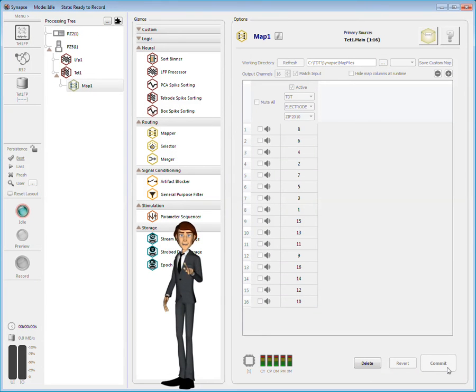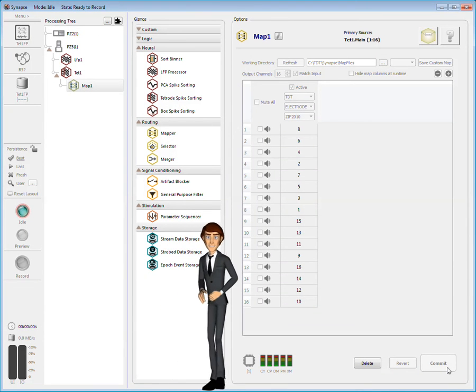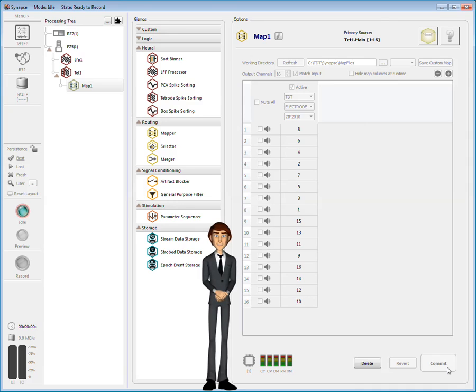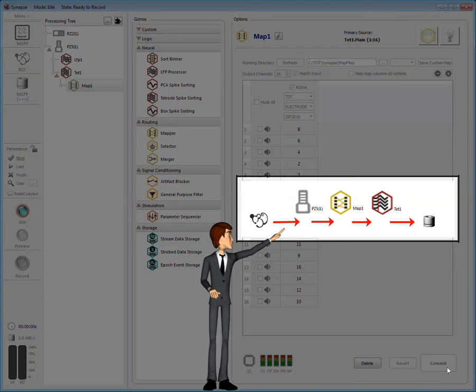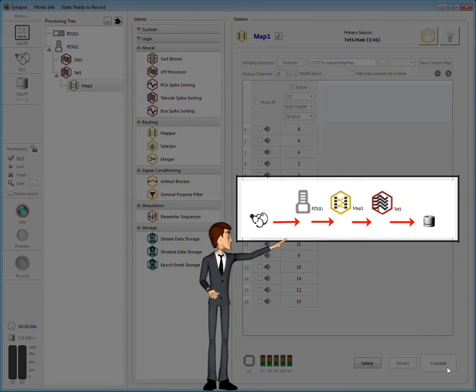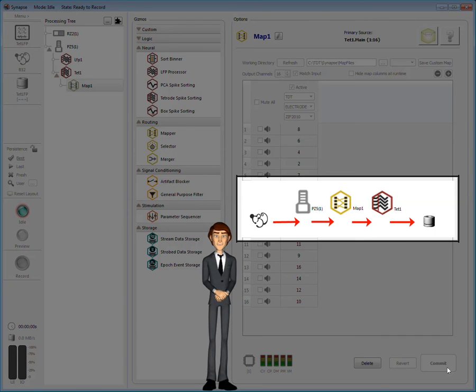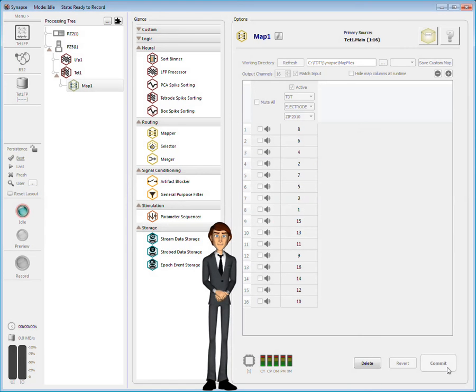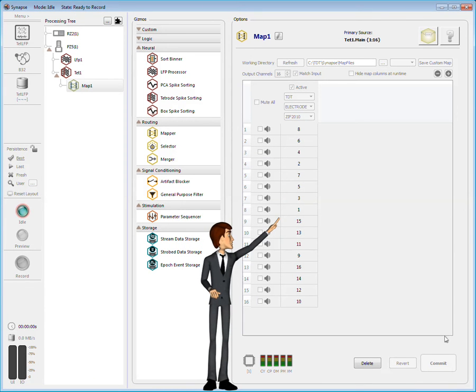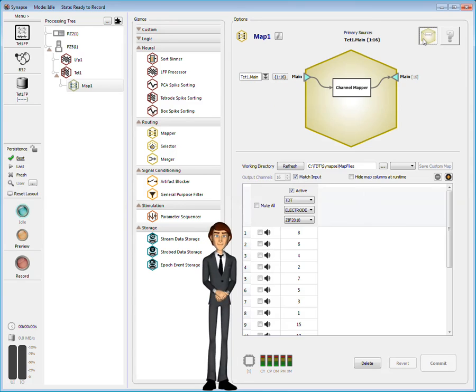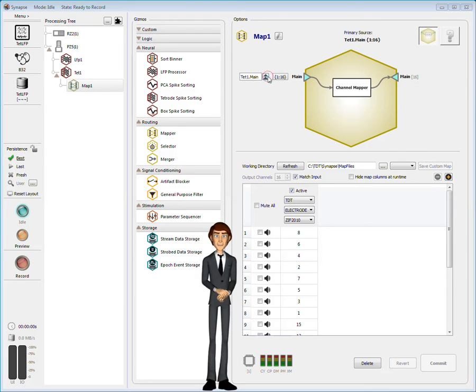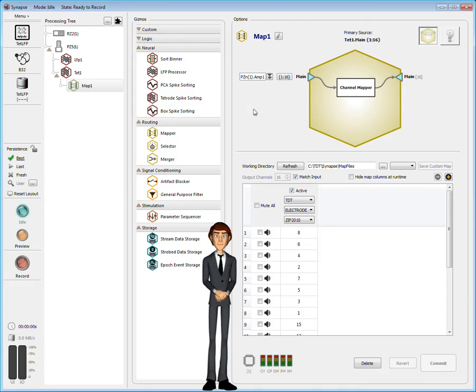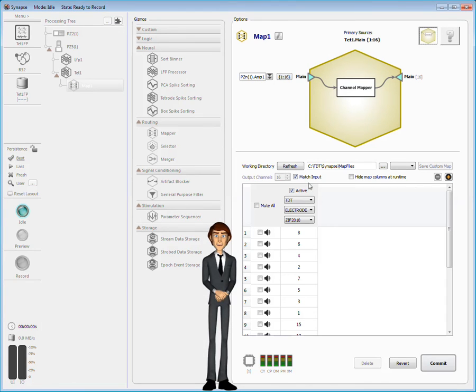Now I'll have to back up. The gizmo needs to be added between the amplifier and the TetRoad gizmo so that the channels are reorganized before sorting. To fix this, I'll display the mapper block diagram. Just like before, I can select the input source and commit the change.